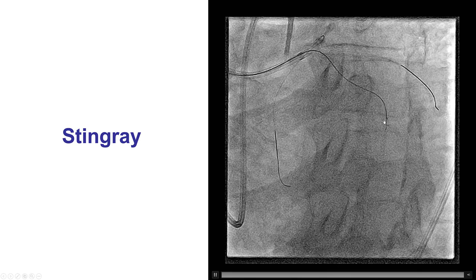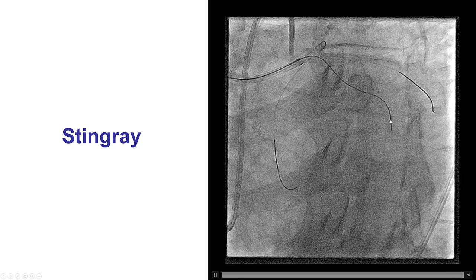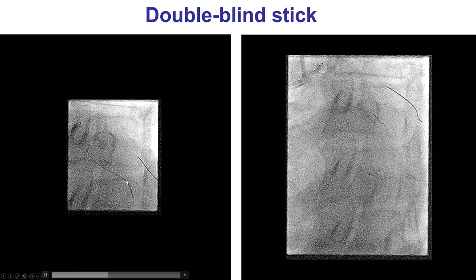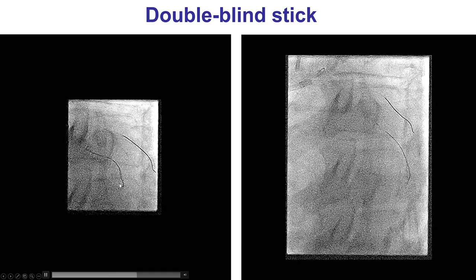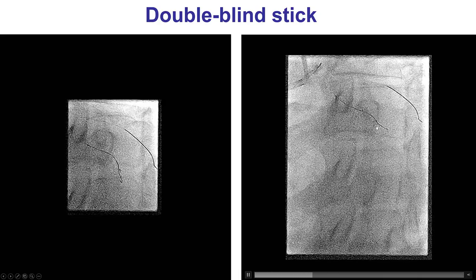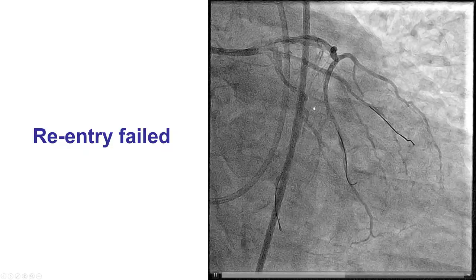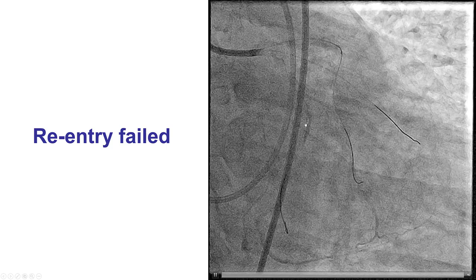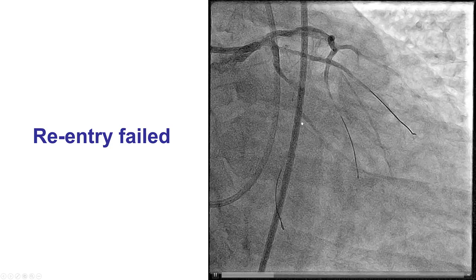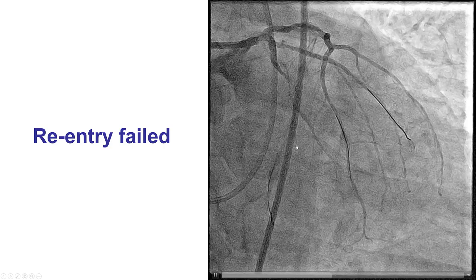We decided to try to re-enter into the true lumen in the circumflex using the stingray balloon, which is a CTO equipment for antegrade dissection re-entry. Unfortunately, despite using the double blind stick and swap techniques — sticking proximal to the proximal marker and between the two markers of the stingray balloon — we were unable to successfully enter the distal true lumen. However, the patient was fairly stable without chest pain or EKG changes, likely because he had significant pre-existing disease in the circumflex.